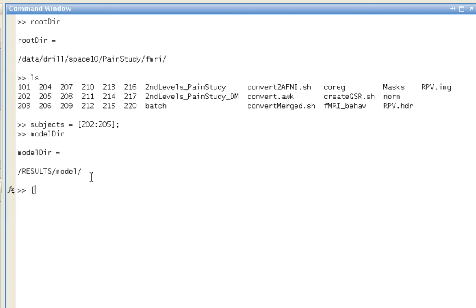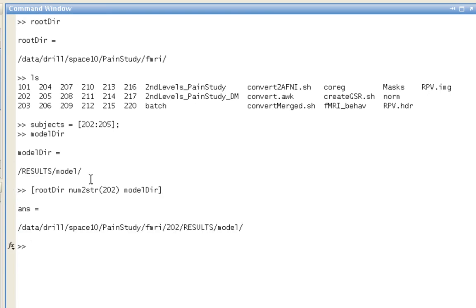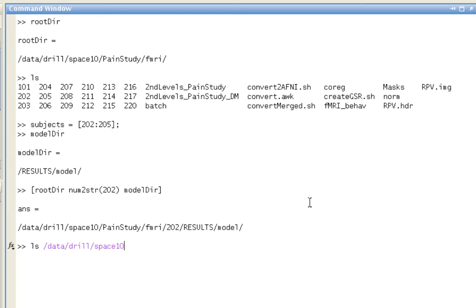If I were to concatenate all of these for an individual subject, such as subject 202, it might look like this: data drill, space 10, pain study, fMRI, 202 results model. That's where the ResMS file would be for an individual subject.